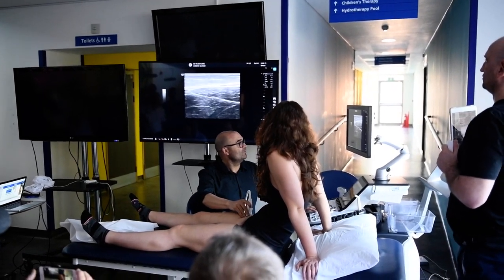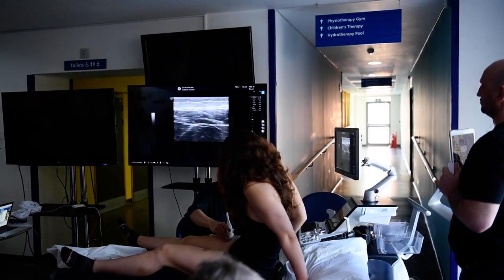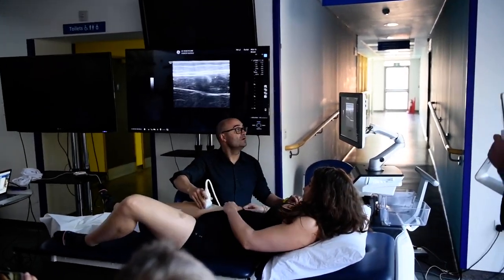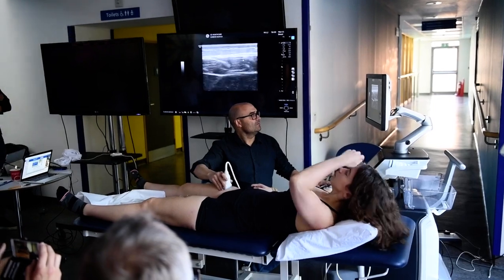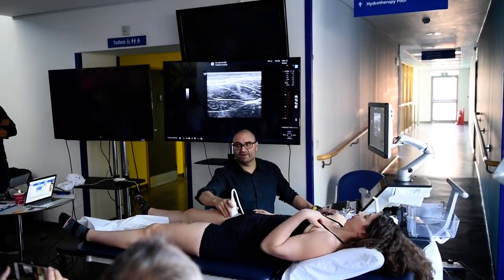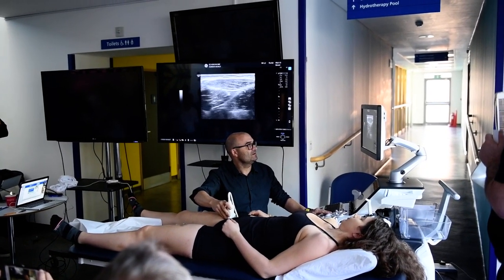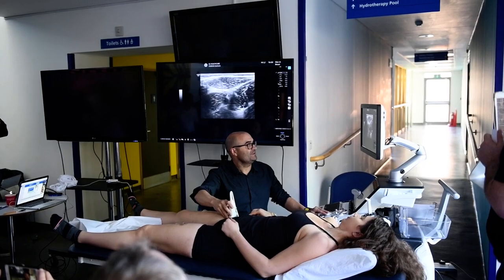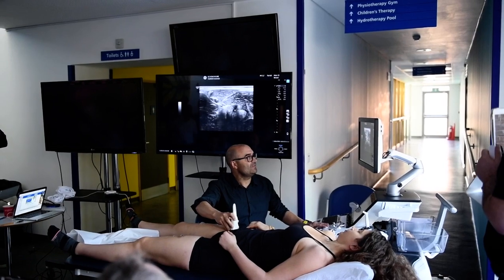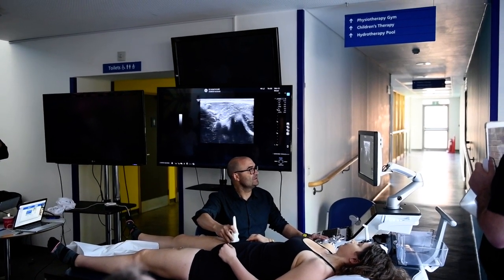Let's move up. You see the sartorius here. I need you to lay down. Move up. Look how the central tendon is moving to that corner here — the sartorius is crossing with the vessels. The central tendon is located here in the corner. We're moving up. You see the shadow, the acoustic shadow of the indirect tendon. We're moving up.